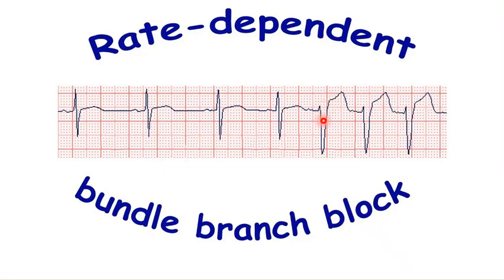And the patient has developed a left bundle branch block configuration. So this patient has sinus rhythm with a rate-related left bundle branch block. So every time he picks up his rate, he develops an intermittent bundle branch block during that rate change. And you see that a lot of times in the elderly.